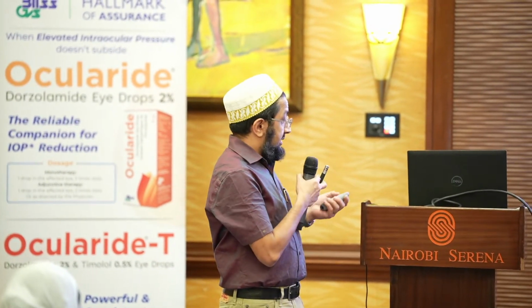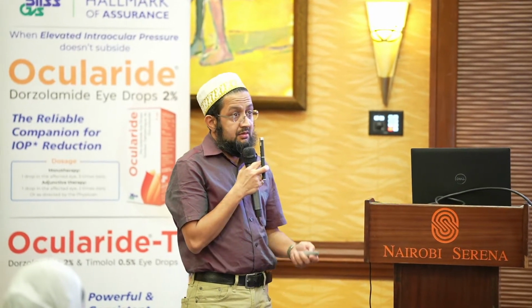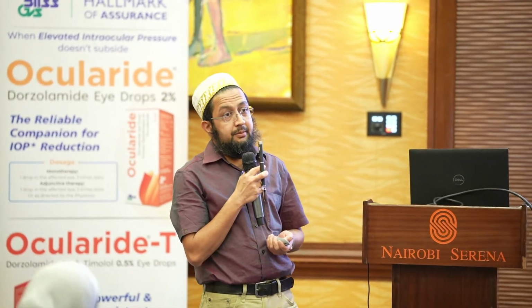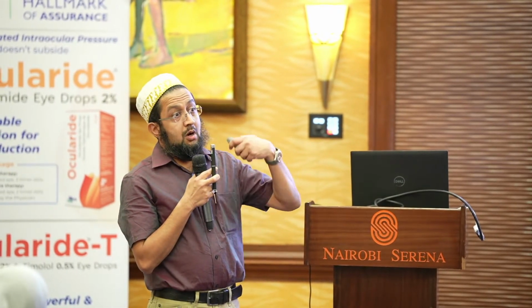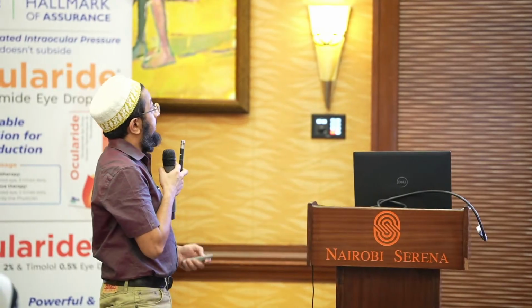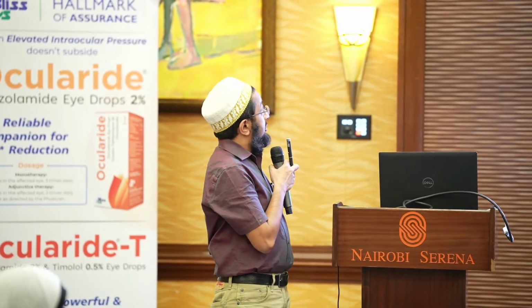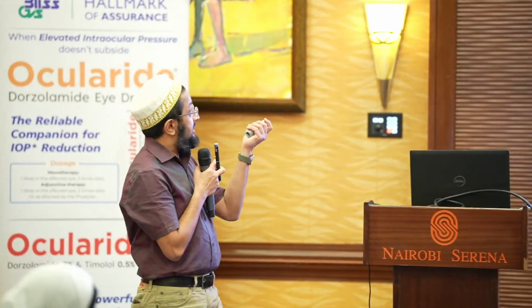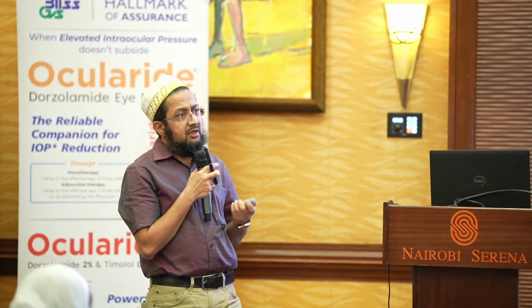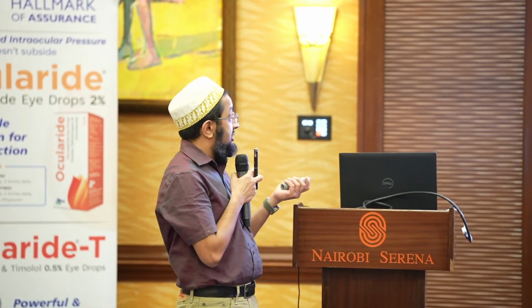So you can see in this image, in the bottom, you can see the KPs in the corneal endothelium. Now, all these have a bearing as to how you're going to move forward in terms of diagnosing the patient. Now, signs, anterior chamber, you'll be looking for cells. This is how we grade the cells, and flare. Flare actually tells you that there has been an inflammation before, not necessarily that there's an active inflammation at the time when you're seeing the patient.